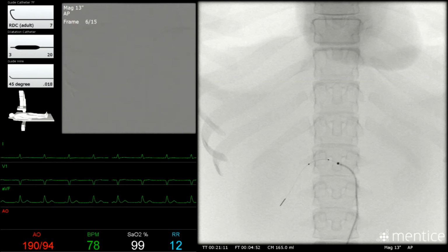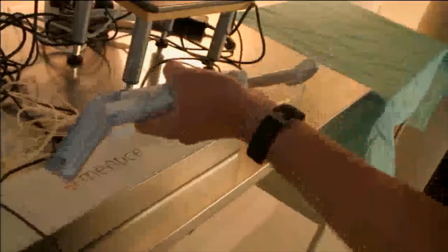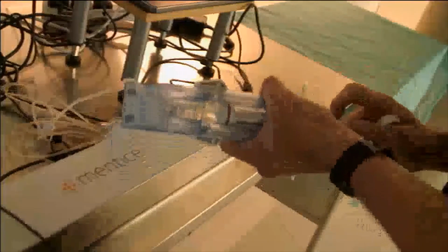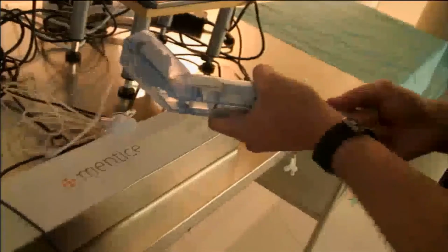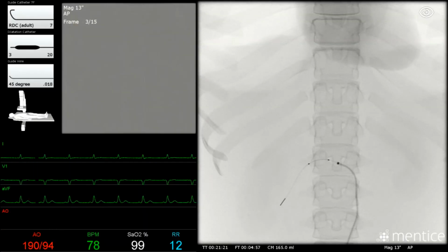To inflate the balloon, we use a physical inflator device very similar to its real-life counterpart. It is filled with water before use and connected to the haptic machine. To inflate, we turn the handle clockwise until we reach our desired pressure. I believe that on some real-life inflators, a pumping motion can be used with the handle. This is not the case with this device, and doing so may damage it. We simply turn clockwise to increase pressure and anti-clockwise to decrease pressure.